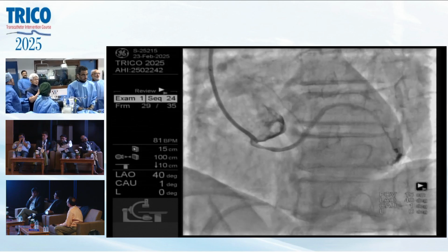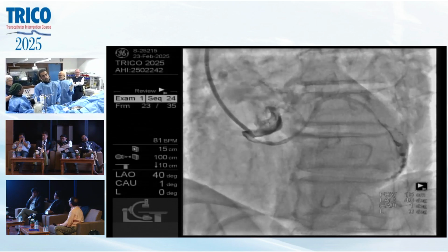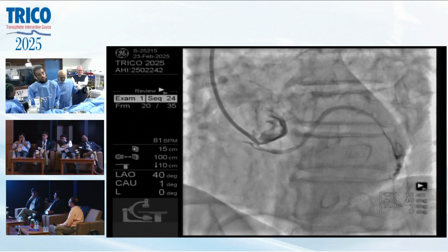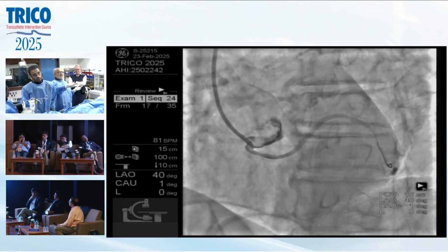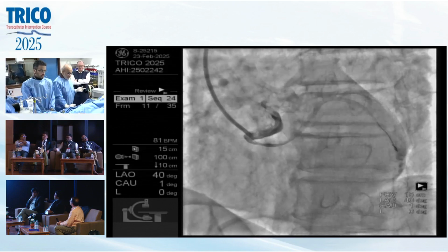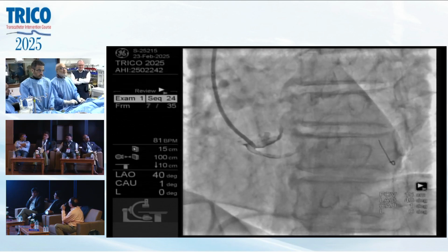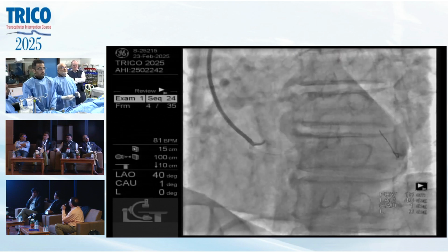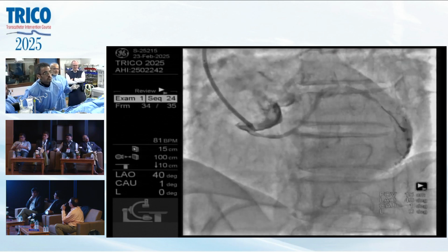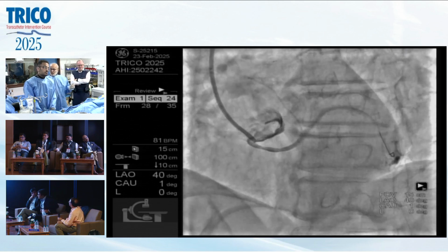Now, how many of you feel that we should check the right coronary with OCT, or that it looks normal? I mean, this result is perfectly fine according to me. Any comment on it? Would you post-dilate the mid segment of the stent? You think so? Right at this time I am blinded because I don't have OCT, but I don't mind doing it.